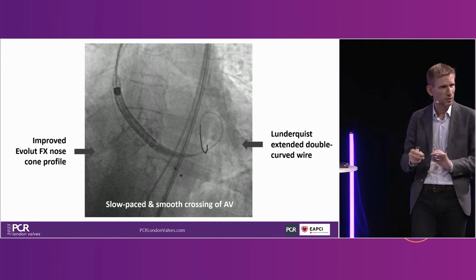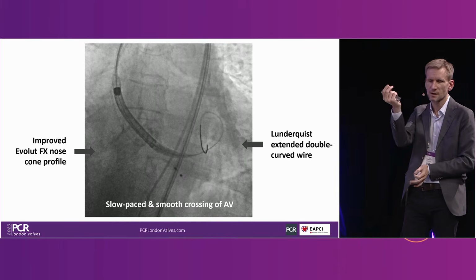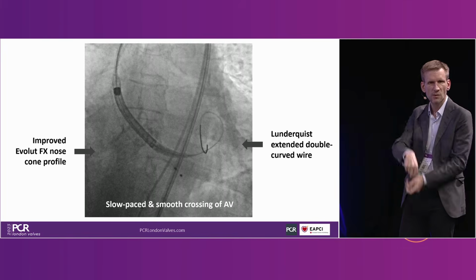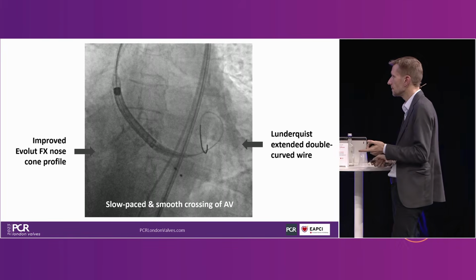If at this stage I would push and I feel like I have to push too much, I would go back into my arch, put my snare across, follow, pull it up. But I didn't need to use it. Do you use this technique consistently with the snare? Yeah.